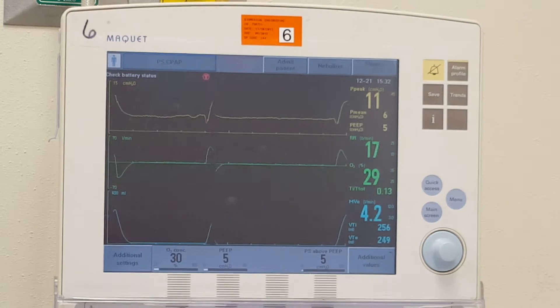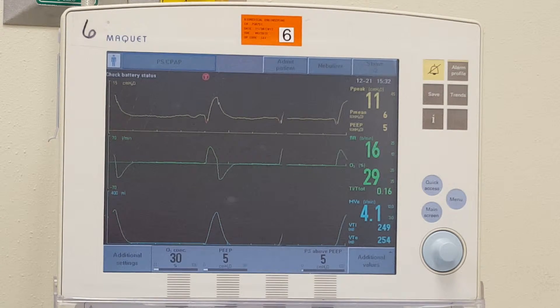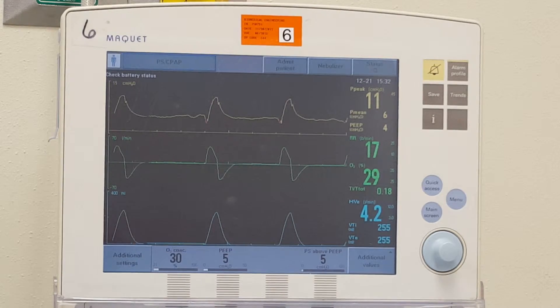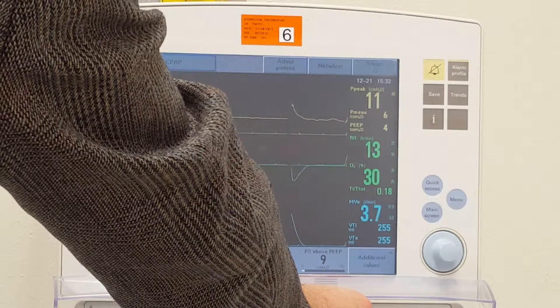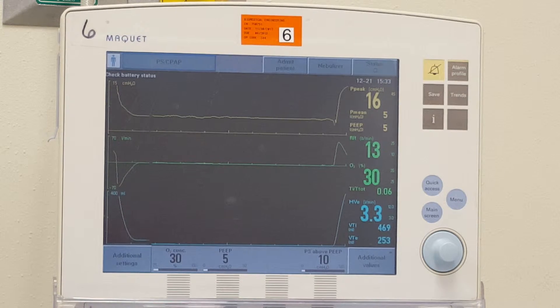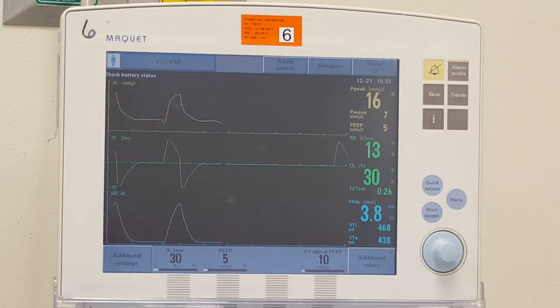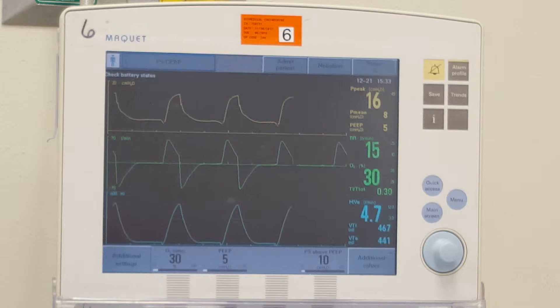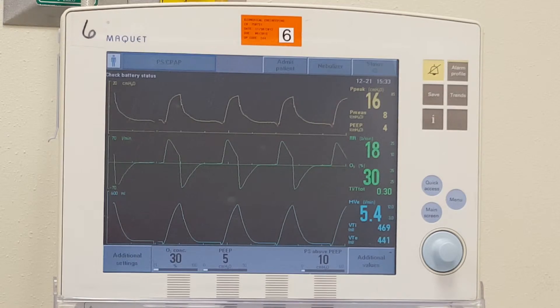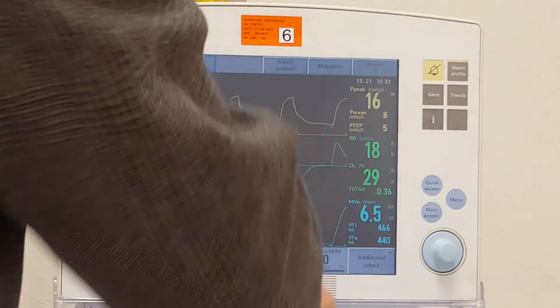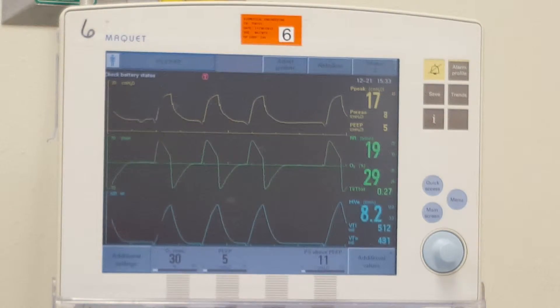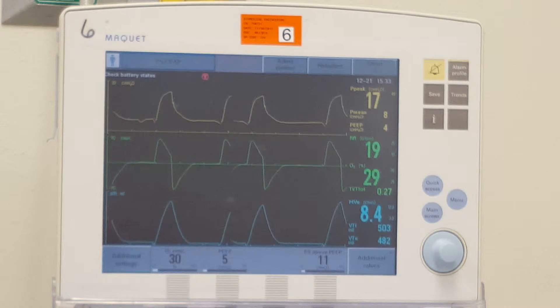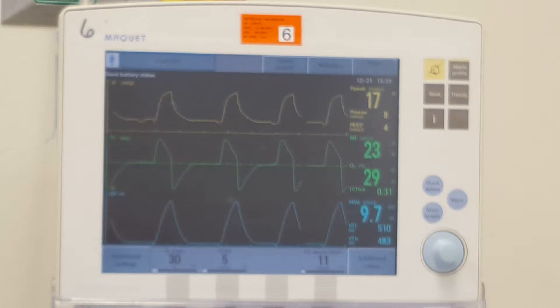Look what our tidal volume is — our tidal volume is only half of that. So we are going to need to adjust our pressure support up by about twice as much — 250 to 500. Currently it's on 5, so I'm just going to put it up to 10. You can see our tidal volume has gone up over 200 mils, but still not quite to 500. So we have to put that up again. Notice now we're just over 500, which remember we were aiming for around 518 or so. We're right in the ballpark at 508, 510.